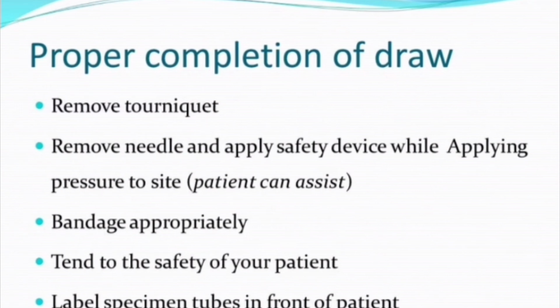Next, proper completion of the draw. Remove the tourniquet, remove the needle and apply the safety device while applying pressure to the site. Bandage appropriately. Tend to the safety of your patient. Label the specimen tubes in front of the patient.